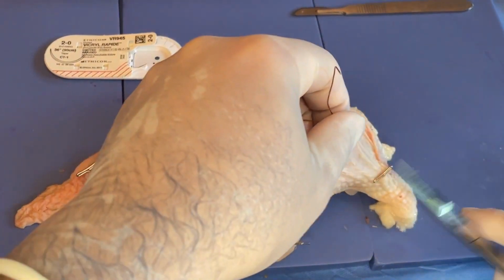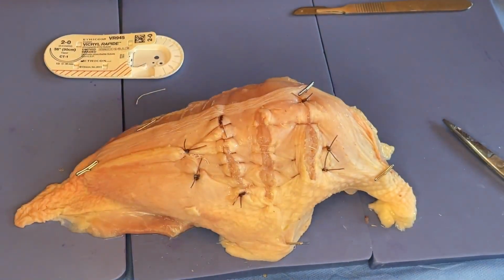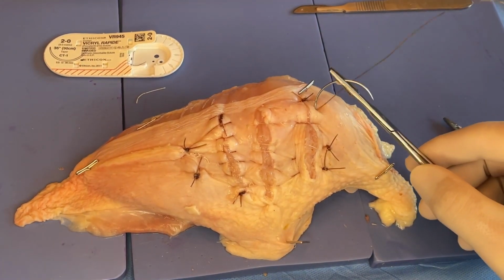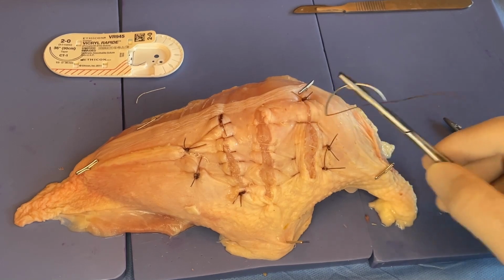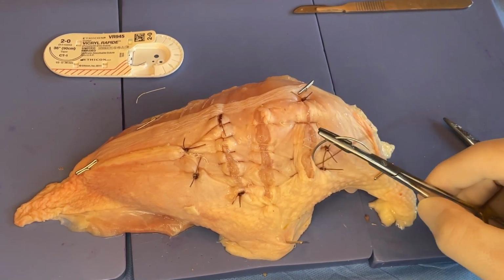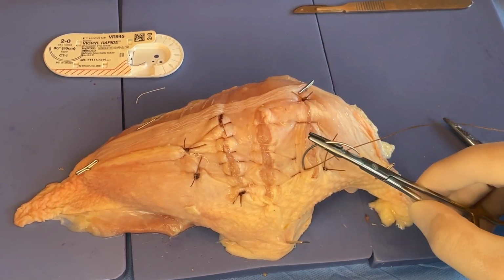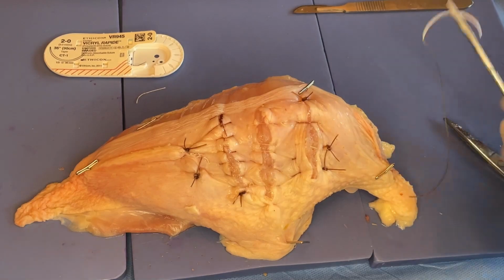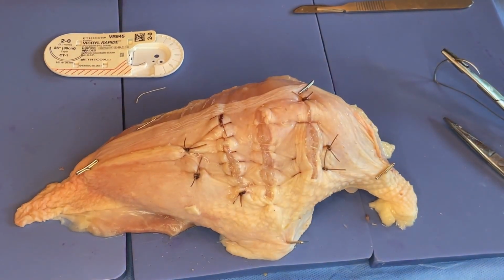Three throws for chromic. You can even see, just in the way this tissue bunches up, the difference between the horizontal and the vertical. The vertical really brings all of that depth of tissue together, and kind of everts the edges a little bit. So, horizontal and vertical mattress.